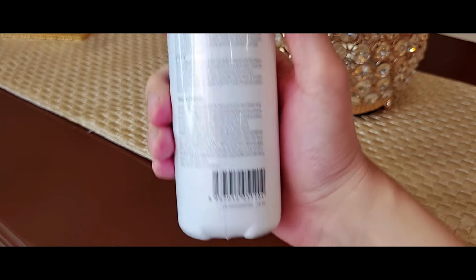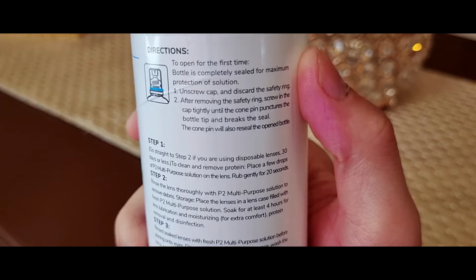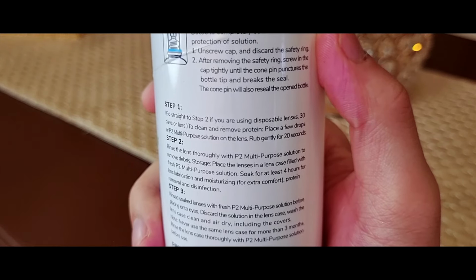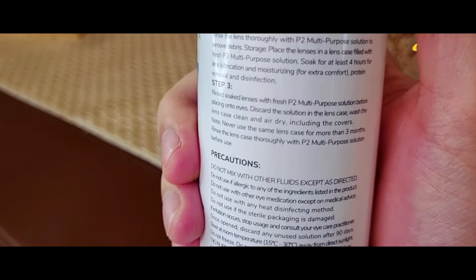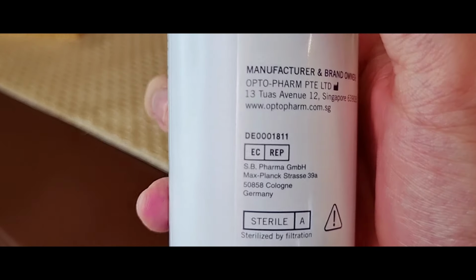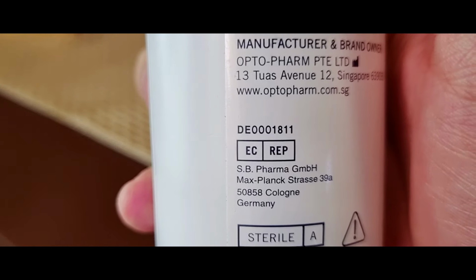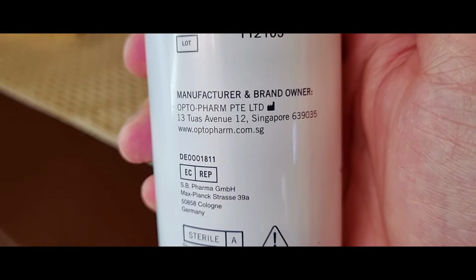So first I thought maybe there's a problem with my contact lenses, or I got an infection. But after doing some research, I found out that the cheap solution doesn't clean the contact lens properly. There would be still protein buildup on them, and secondly, it won't really moisten them properly, due to which you will start to have these kind of problems.